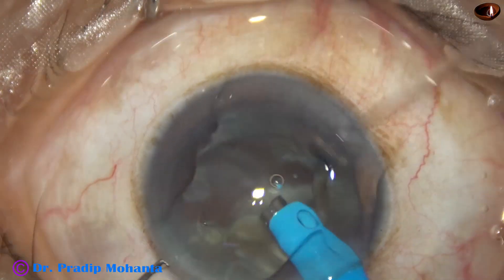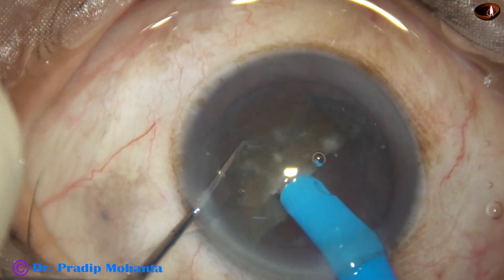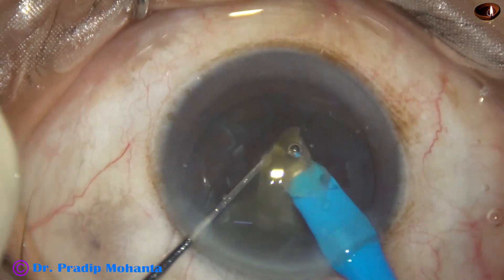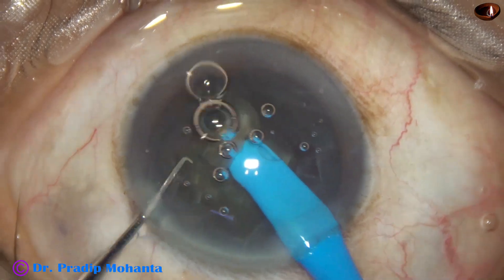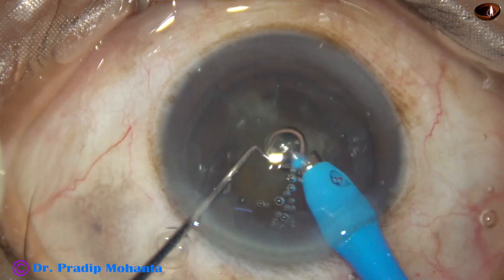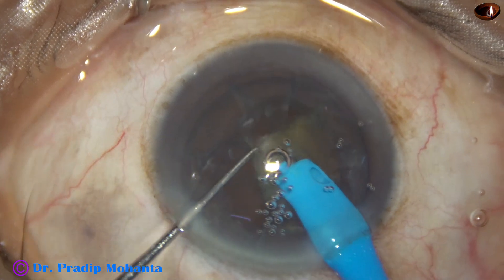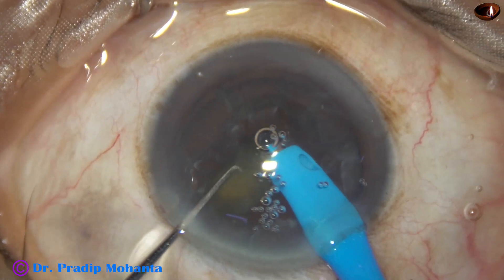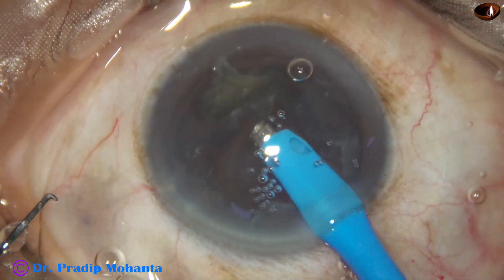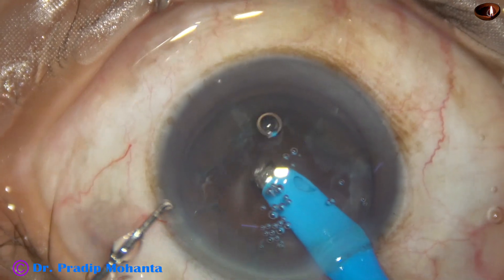Whenever followability is less, I remove the chopper and the followability increases. This is the other hemi-nucleus; vacuum is 450 mmHg. This is the last piece of nucleus being emulsified at the same vacuum of 450. Ultrasonic energy was 75% and flow rate 45 ml per minute.